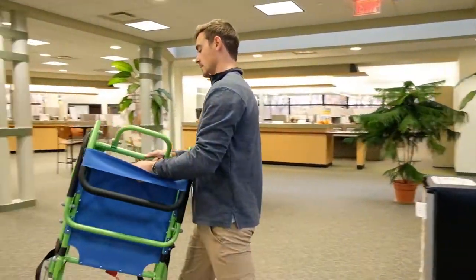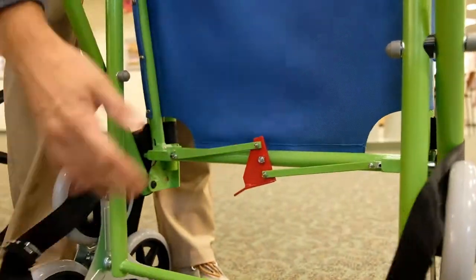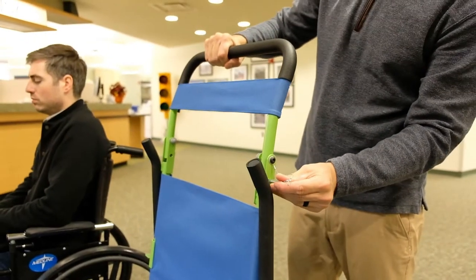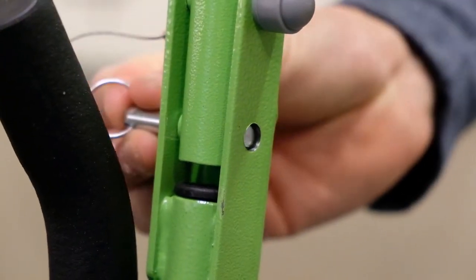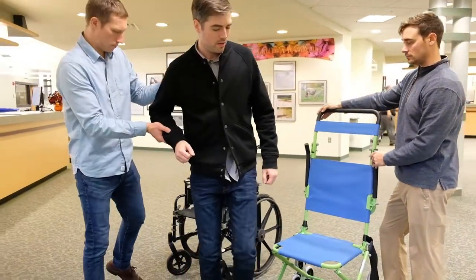Begin by removing the chair from its storage location and placing it on the ground. Undo the safety belt and let the straps fall to the sides. Unfold the seat and lift the handle upright, inserting the safety pins into each side to secure it in place. Transfer the person onto the seat according to your personal emergency evacuation plan.